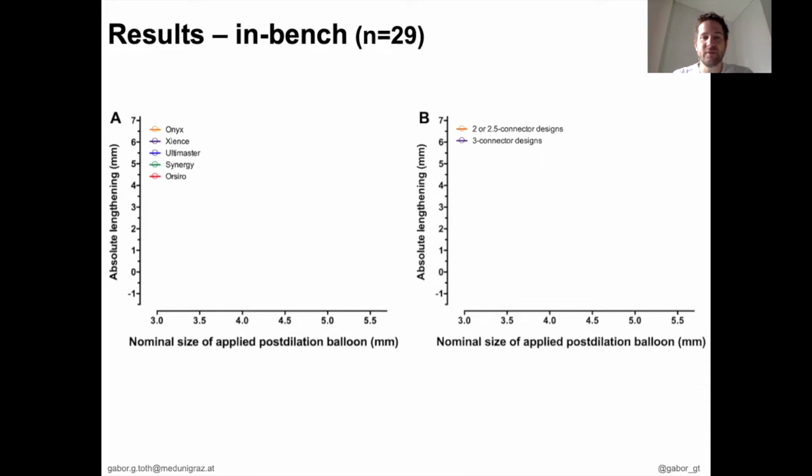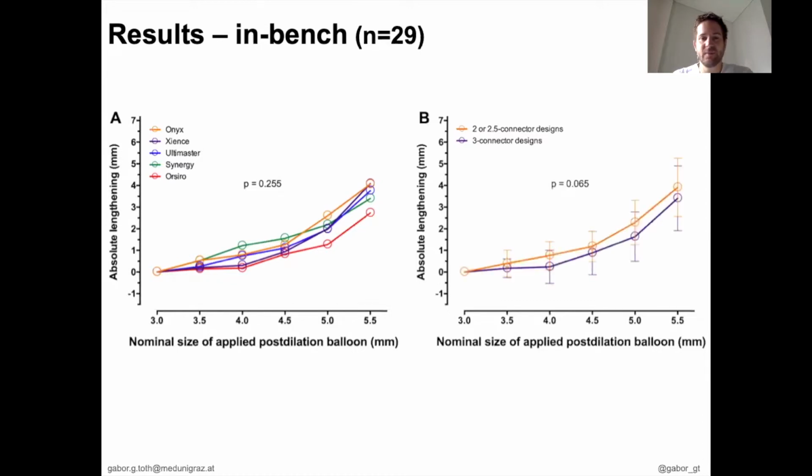Comparing different stent brands, we haven't seen any difference, neither when we compared 2 versus 3 connector designs.